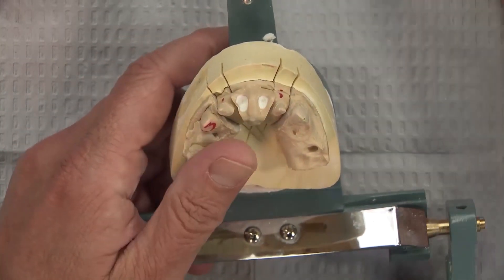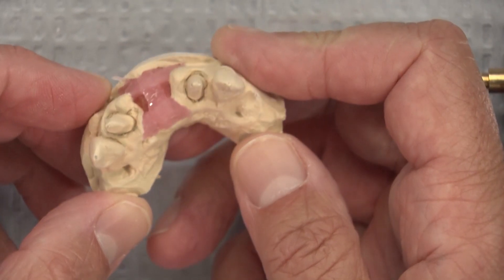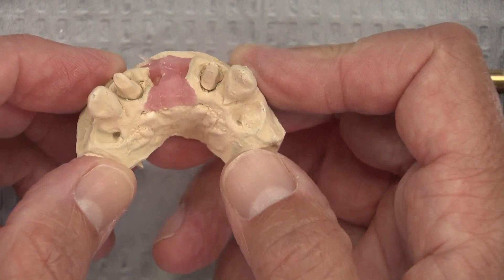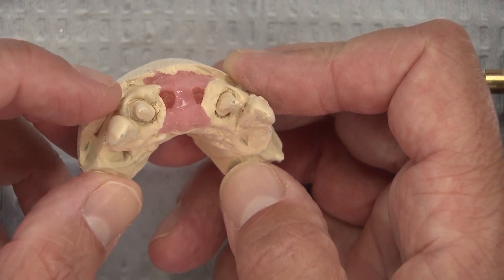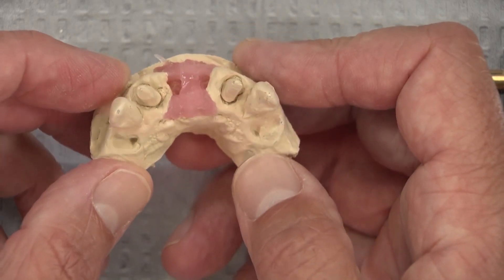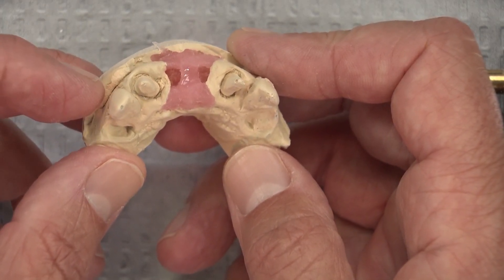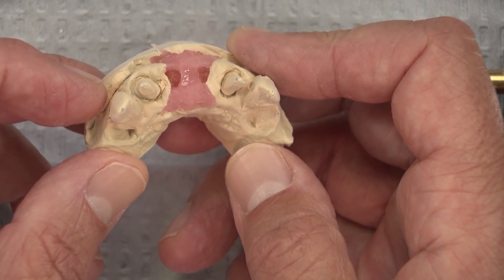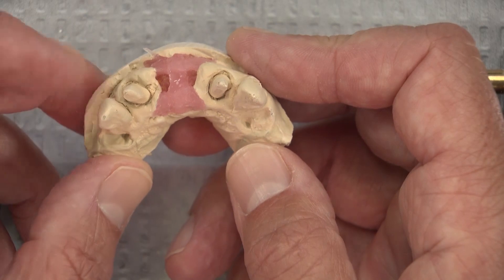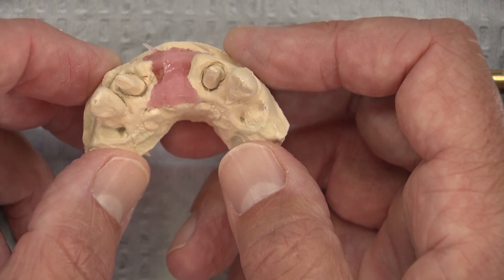As we look at the preparations on the solid model: good retraction. I can definitely see all the way around that prep — not quite as clean on one side as the other, but pretty close and not bad. The preps appear to be smooth; you don't see any coarse bur marks. But if we try to get the path of insertion and view down, I can see the margin all the way around one tooth, but if you look at the other tooth, we can't see it. This is obviously way easier to see out of the mouth than in the mouth.